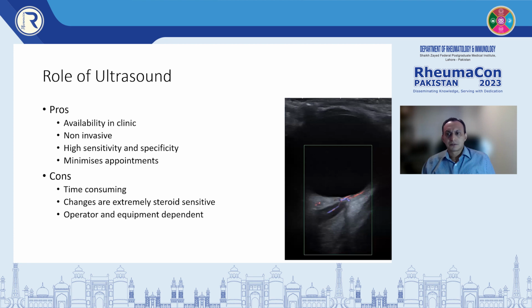So when we look at the role of ultrasound in general in managing GCA, the key things which make it a very useful tool is that it is available at the point of care. You don't have to wait for the patient to go somewhere else and get an investigation done. You can perform the ultrasound there and then in the clinic at the time of presentation when you know what exactly patient's clinical symptoms and signs are, and that can give you confidence in diagnosis. It can also be performed very quickly, and it's a non-invasive technique. It does not require surgical intervention or anesthetic.